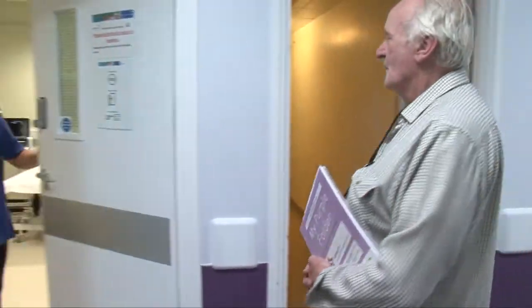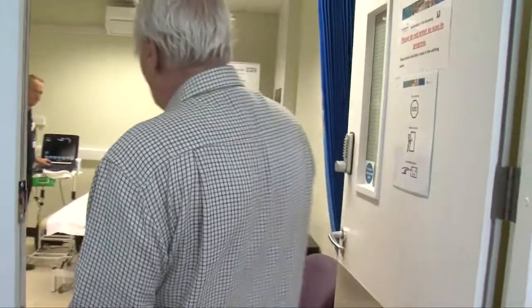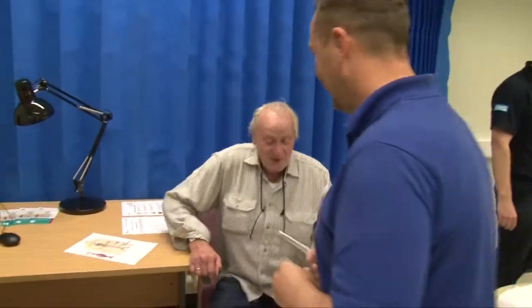The first thing that is going to happen to Robert is a scan. The two technicians explain to Robert about the scan, using information he will understand. Robert can ask any question he likes, and they will answer them and tell him what's going to happen.